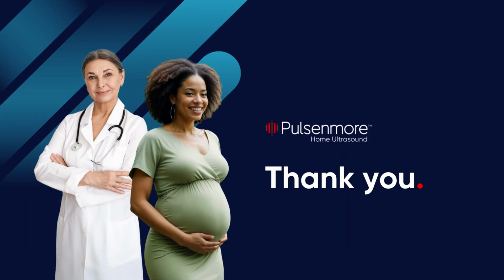This concludes Part 3 of the Pulsenmore training on clinical side setup. The next part, we will cover all aspects of reviewing Pulsenmore ultrasound scans.